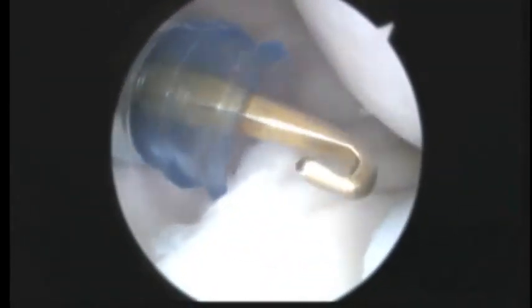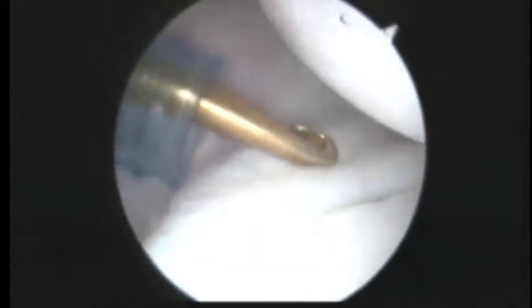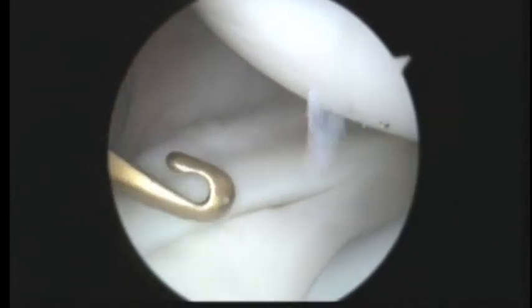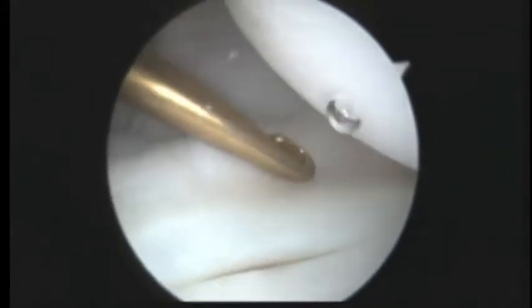Okay, Dylan, so now the camera's in the front. This blue cannula is coming in the back of the shoulder, and this gray cannula is coming in the front also. And so now what we're doing is we're looking towards the bottom of the shoulder. If we were talking about this as a clock, 12 o'clock would be up here, this would be 9 o'clock, 6 o'clock would be down here. So we're looking from top to bottom.